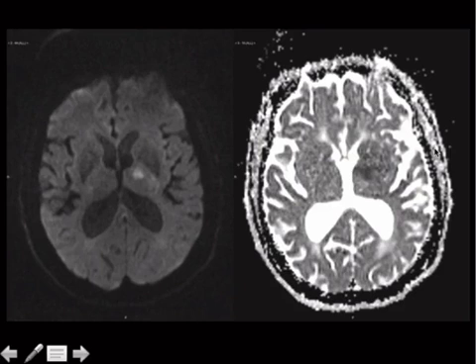T2 shine through occurs when lesions or areas have a very long T2 decay time, and they're going to remain bright on the diffusion or the trace image. So it's difficult to know whether they represent an area of restricted diffusion or not, but by producing these ADC maps, that allows you to differentiate between them by correlating with the ADC. So in other words, bright thing here, dark thing here, real. A little bit of bright stuff here, little bit of bright stuff here, not real, T2 shine through.